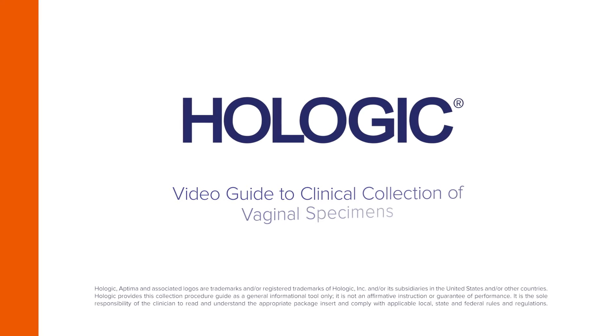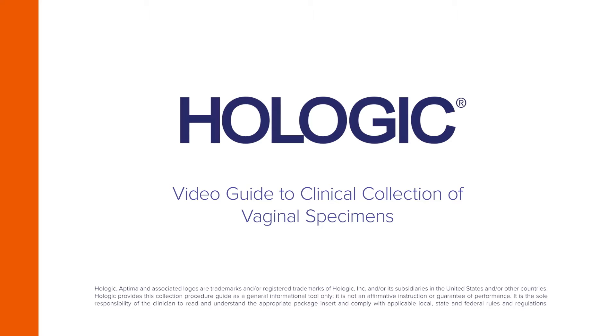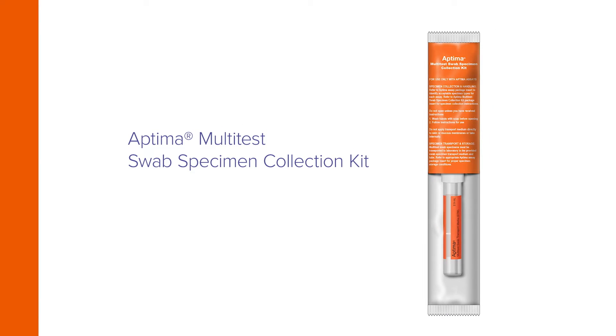Hologic presents a video guide to collection of vaginal specimens by clinicians using the Aptima Multitest Swab Specimen Collection Kit.